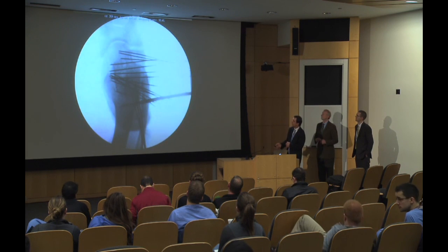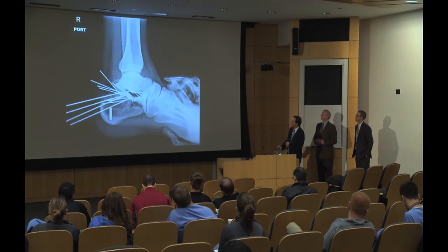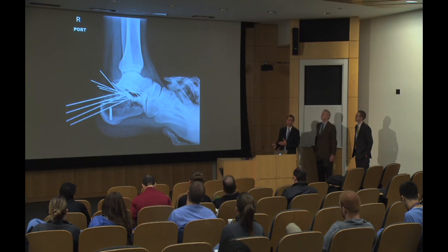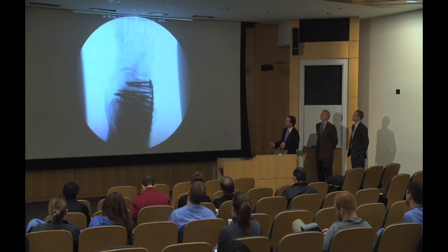This just shows you the intraoperative realignment of this large portion of the posterior facet to the sustentaculum, and then subsequently the area of compression. So this is really a relatively unusual injury because it's discontiguous with the entire posterior facet, but if you don't compress it, there's going to be difficulties with translation. As Bruce mentioned, the medial side is essentially subluxed medially, and so we reestablished the medial wall, and then this is just showing the fixation and then the compression.